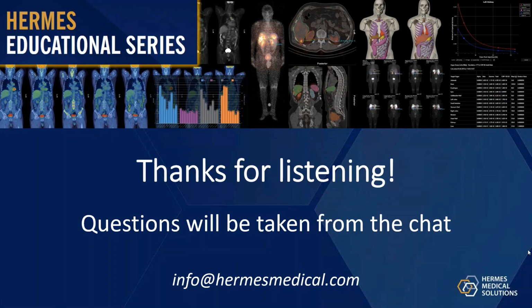pediatric doses. We have done research work where we compared the full and half dose imaging. This was in adults and in cardiac SPECT, and we noticed that the hybrid recon can handle the much noisier data well, and we get better quality images with the half dose when compared to the full dose and standard reconstruction method. But for pediatric patients, we haven't done any research work.